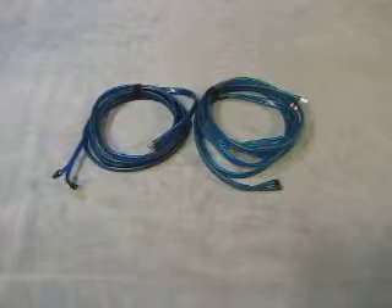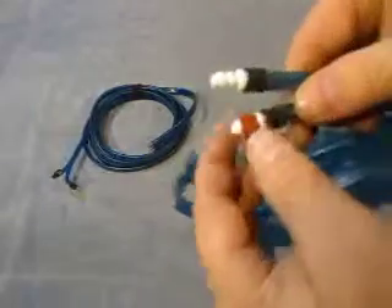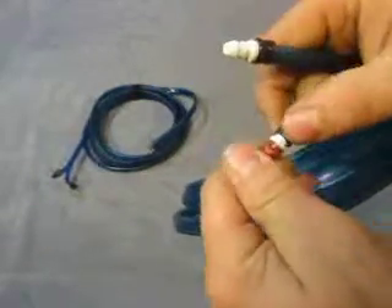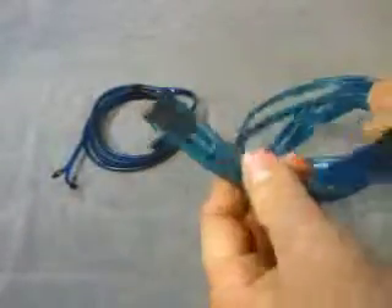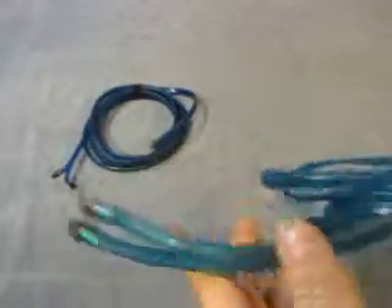Up for auction we have a lot of two blood pressure cables. We have two at this end here. Here's the ends that go on — it screws on and goes on to the cuff. There's two here, and then two that hook onto the machine, probably for a patient monitor or a blood pressure machine.